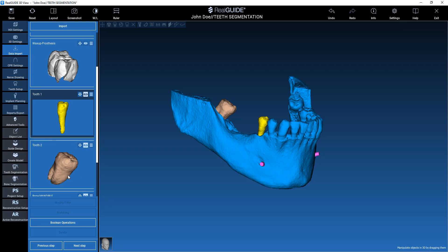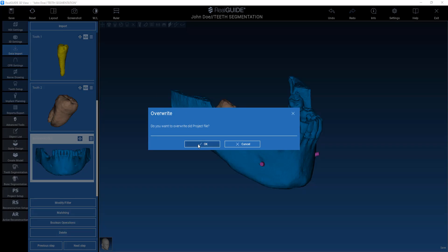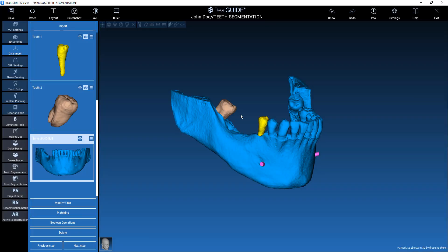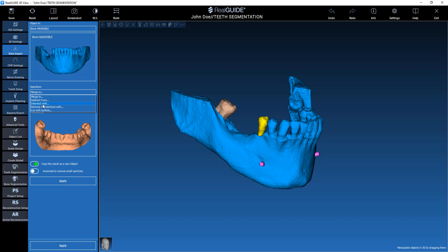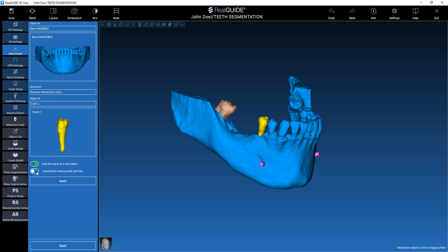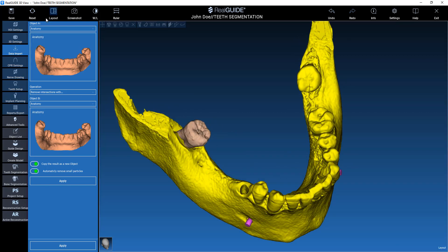I take my mandible and save the project. Boolean operations can be quite critical depending on the file size, so save before performing boolean operations. Then I select my mandible, remove intersections with tooth number one. We already removed small particles before — click apply. And we have our first file done.